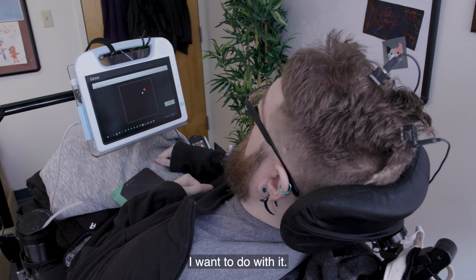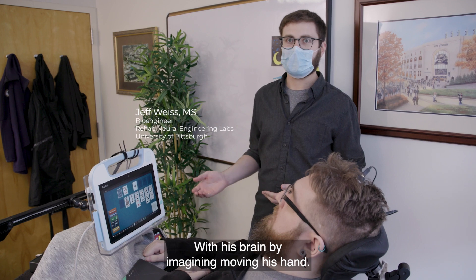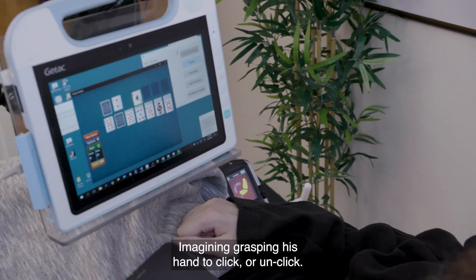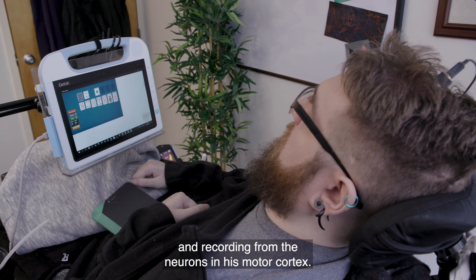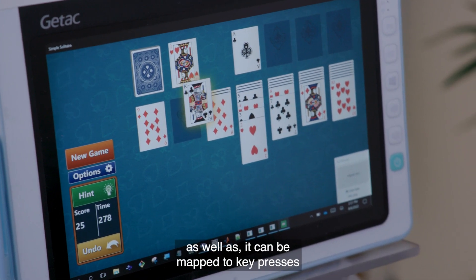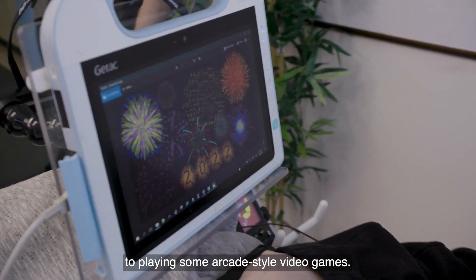Nathan is controlling the solitaire game with his brain by imagining moving his hand and imagining grasping to click or unclick. This was trained using a cursor task and recording from the neurons in his motor cortex. It can be used for tasks like painting to make art, and it can be mapped to key presses for playing arcade-style video games.